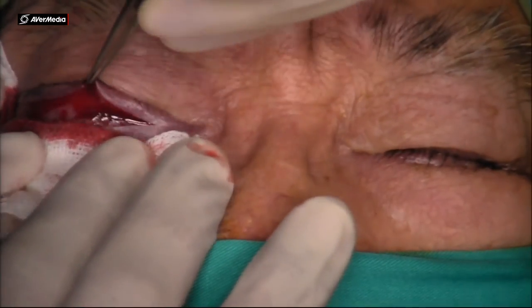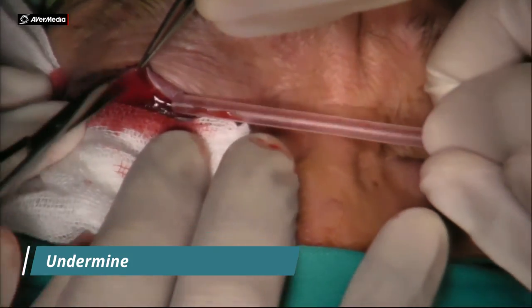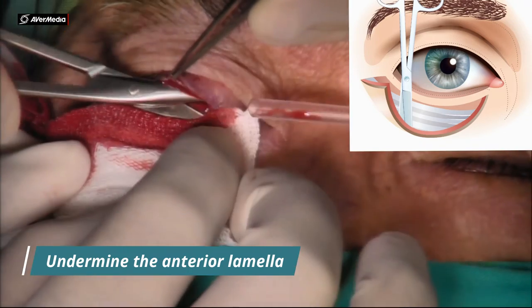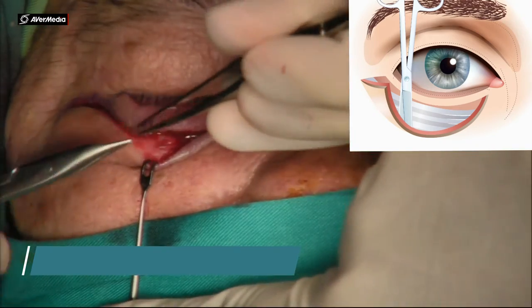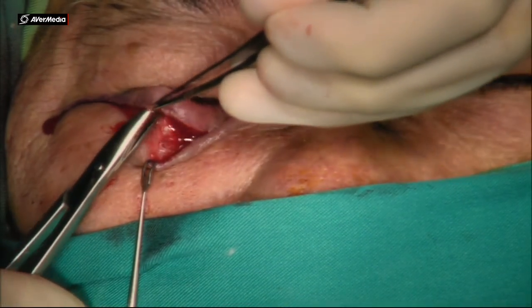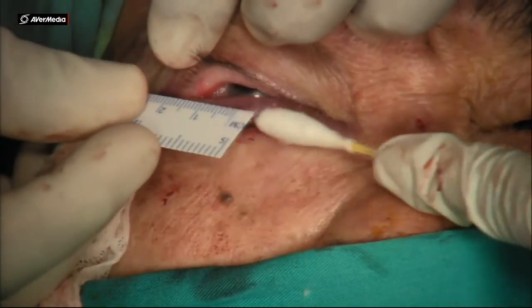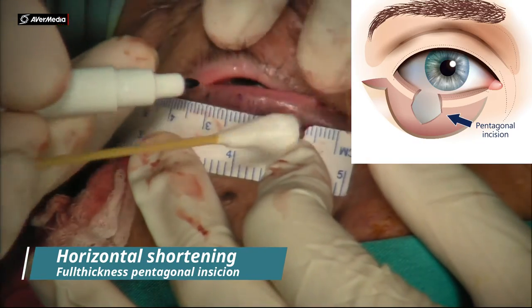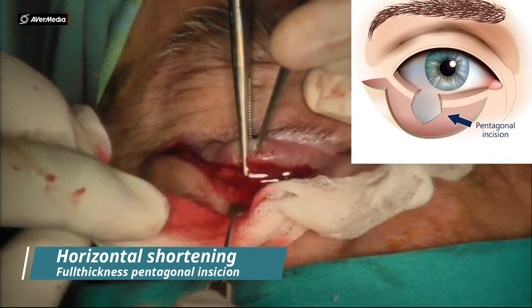We controlled the bleeding using bipolar cautery and adrenaline-soaked tools. We deepened the skin incision, separating the anterior lamella and preserving the orbital septum using Stevens scissors. We continued with measuring the length of horizontal shortening needed, then made a full-thickness pentagonal incision using Stevens scissors.